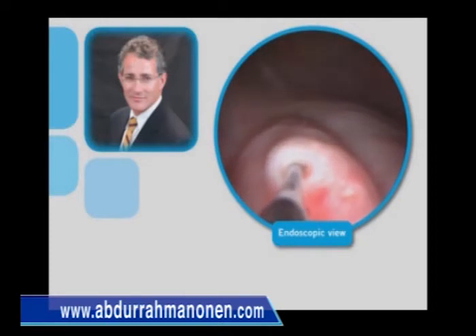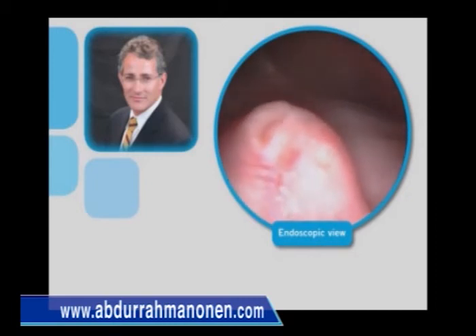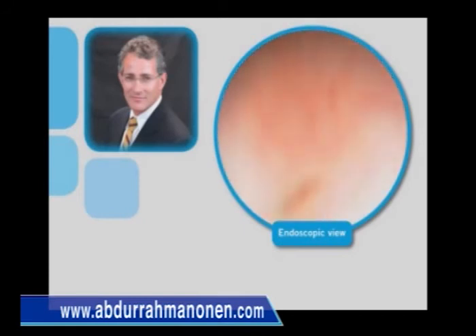It is important to note that when the orifice is in close proximity to the lower pole orifice, as shown here, injection of the lower pole will coapt the upper pole by virtue of this proximity.